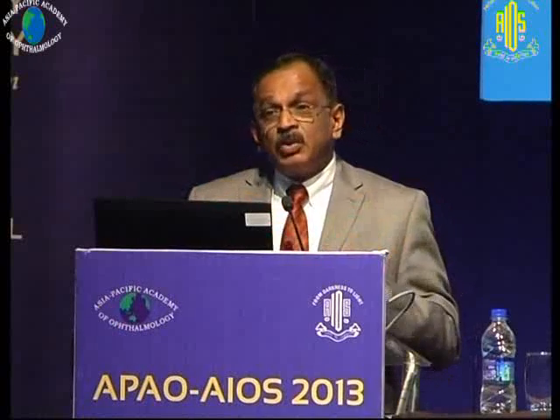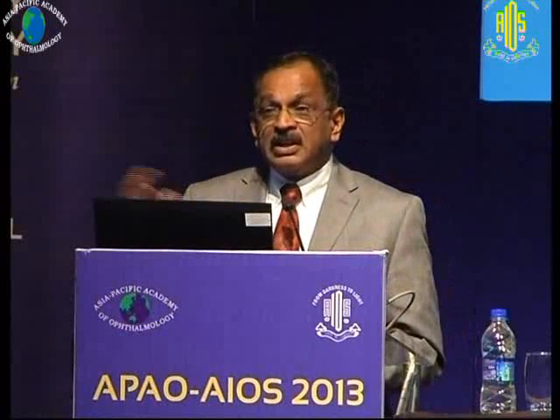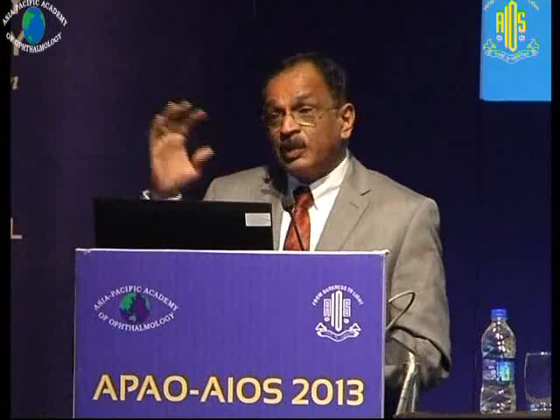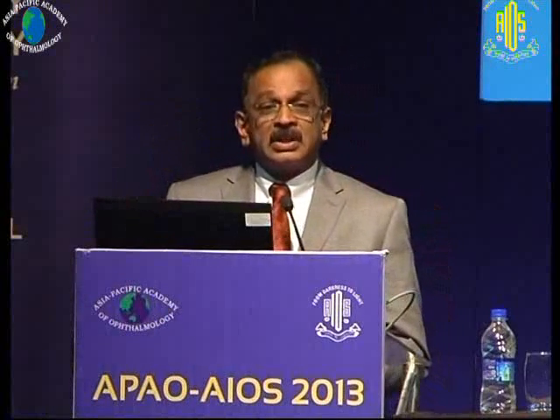Because sometimes the retina would flatten under the PFCL, and then after some time when you do a fluid-air exchange, you realize that there is a small elevation because of this. So you ensure that all these bands are removed to flatten the retina.